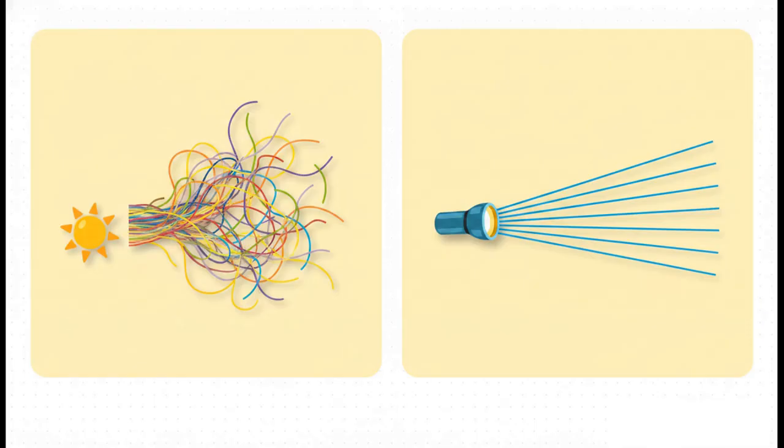To really get this, let's compare everyday natural light to a laser. Most light, like sunlight or a regular old incandescent light bulb, produces what we call thermal light. It is chaotic. It's made up of a bunch of different wavelengths just emitting independently, with random intensities and totally unrelated phases. Laser light, on the other hand, is fundamentally different. It is highly ordered, very directional, and highly coherent. Its internal electromagnetic field is much more like a smooth, continuous wave, which makes it absolutely perfect for generating those stable interference patterns we need.